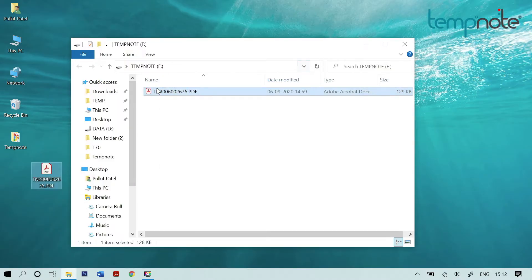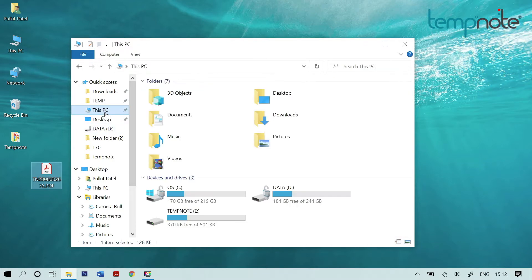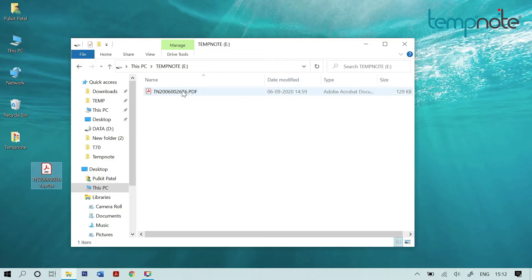If auto popup is disabled on the computer, the folder will not pop up automatically. In that case, go to My PC and open the TempNote folder. The PDF file can be retrieved from there.